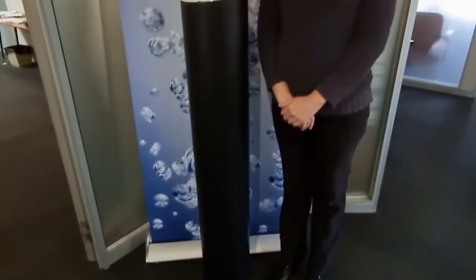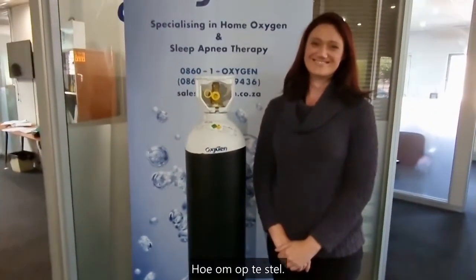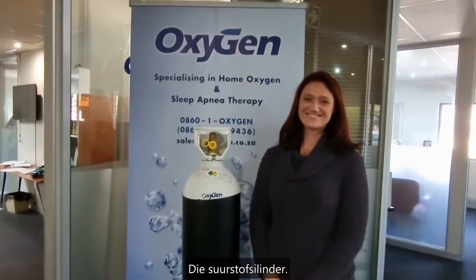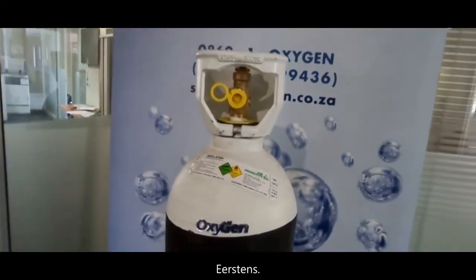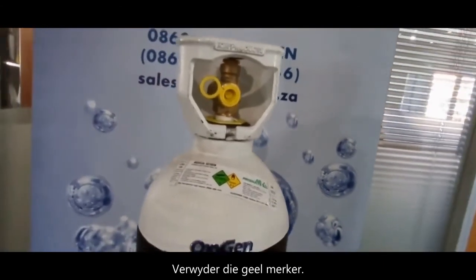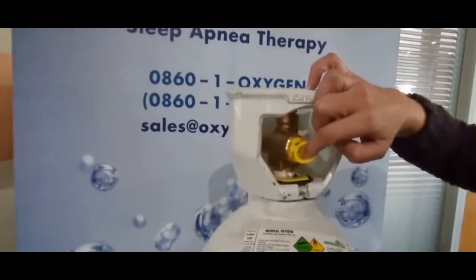This video will teach you how to set up the oxygen cylinder. First, remove the yellow tag like this.